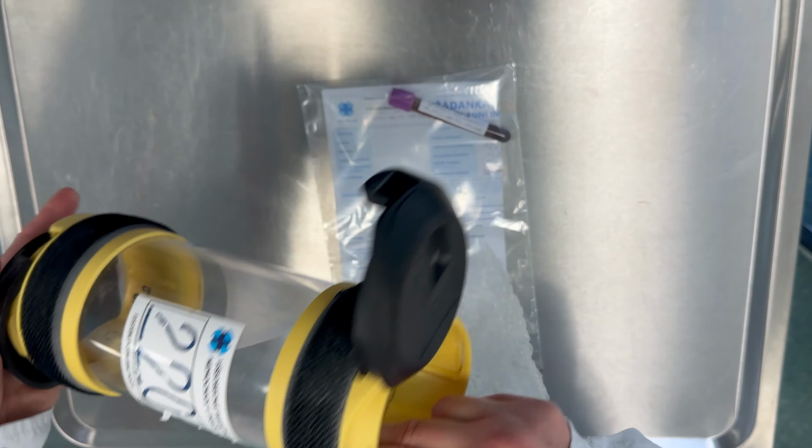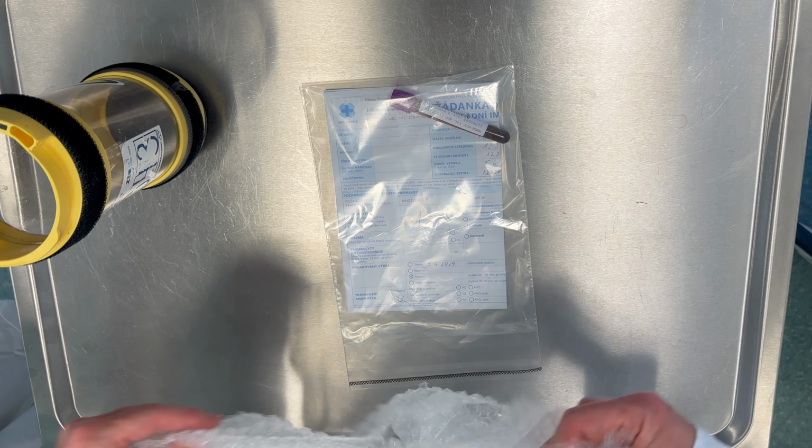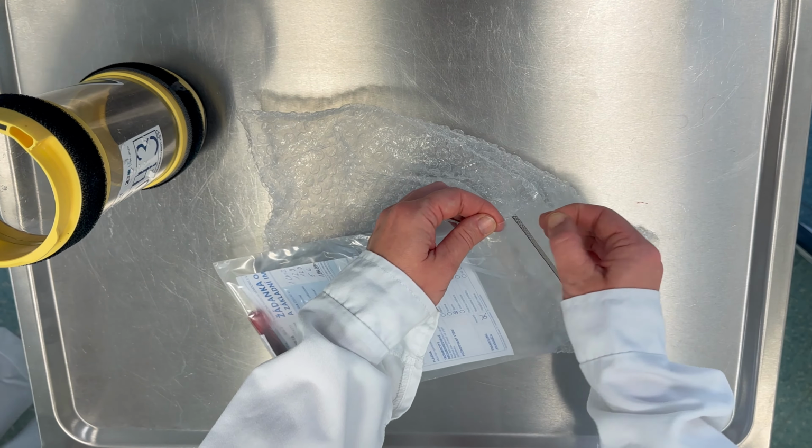the lab. Together with another qualified staff member at the patient's bedside, a double check of all identification details is performed in medical records, on the sample tube label and on the request form, including checking that the collection was performed on the correct patient according to the ID data on the identification bracelet before sending the samples to the FTO. This double check must be confirmed with full identification in the medical documentation.